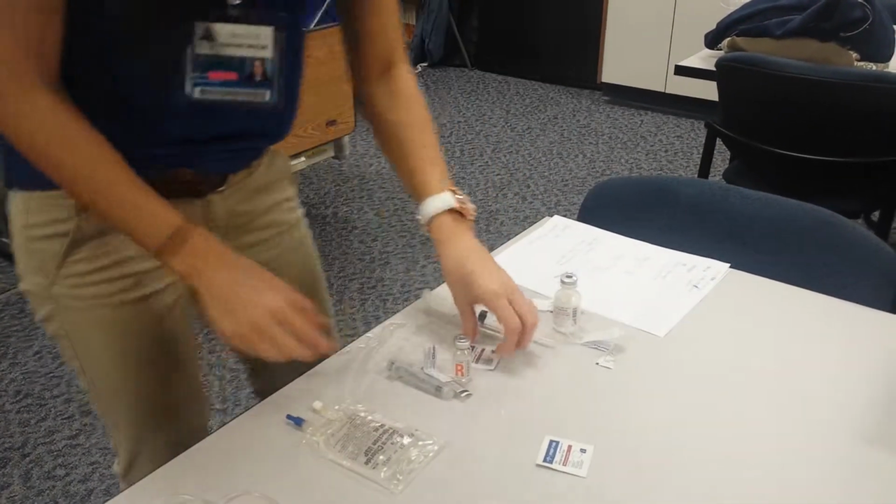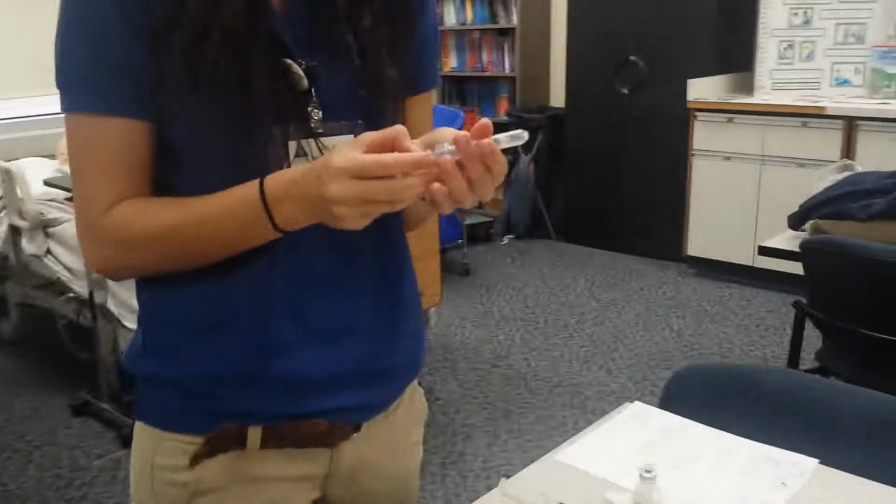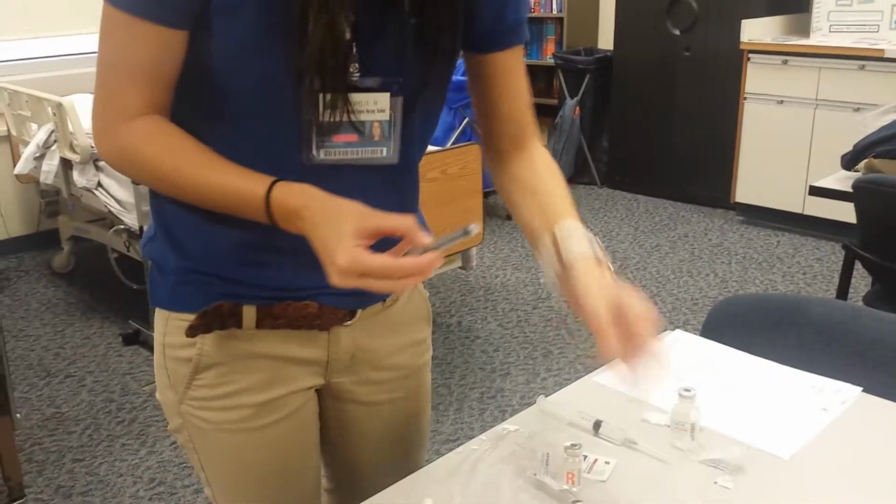Okay, and now I'm going to draw up the vancomycin, 2.5 milliliters for our 500 milligrams.